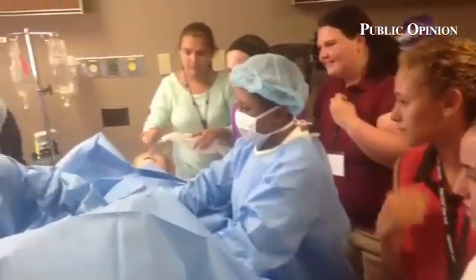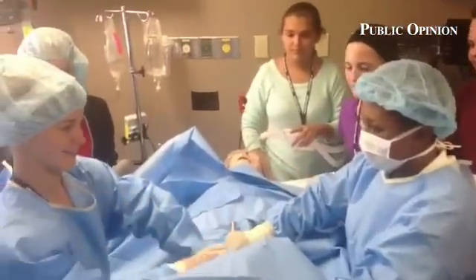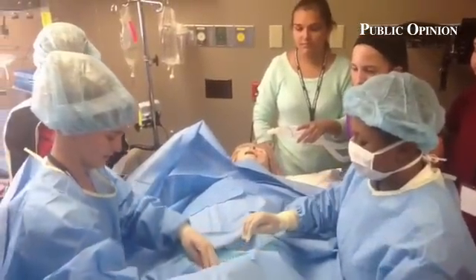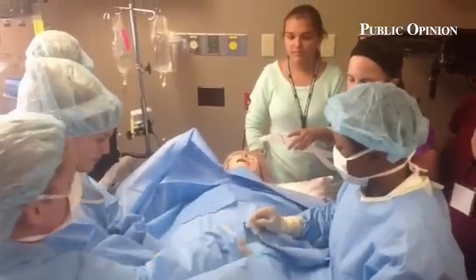All right, now put your hand in there. You're going to feel the baby's head. And you're going to have to help, so let's get to it. What you're going to be doing is sitting up here helping get the baby out.